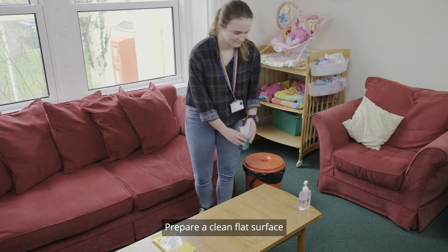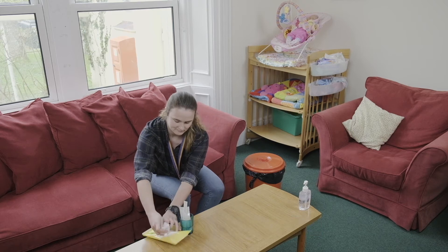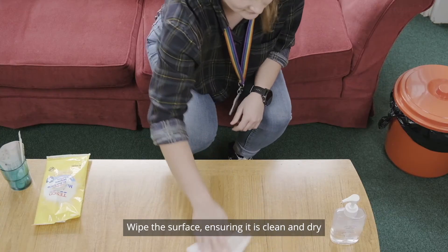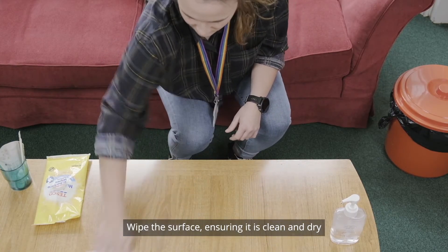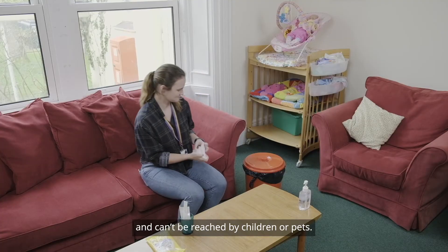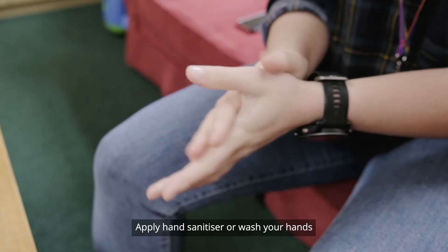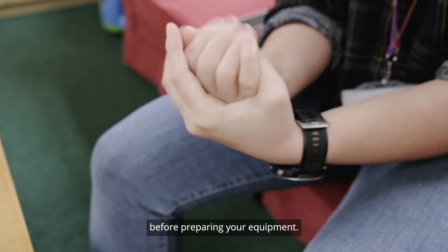Prepare a clean flat surface and allow 30 minutes to complete your test. Wipe the surface ensuring it is clean and dry and can't be reached by children or pets. Apply a hand sanitiser or wash your hands before preparing your equipment.